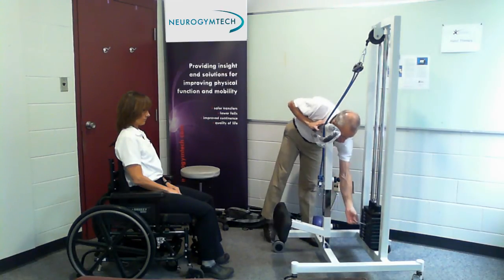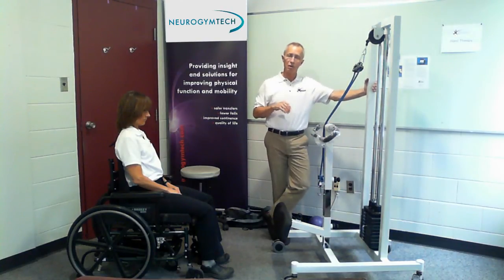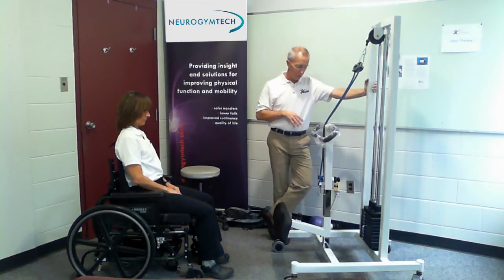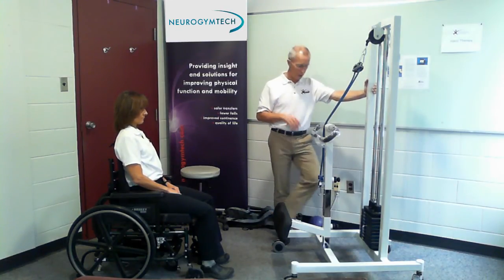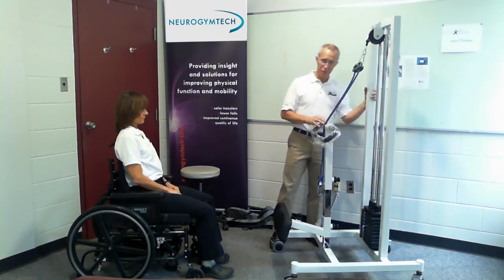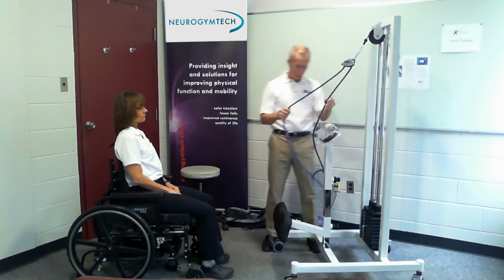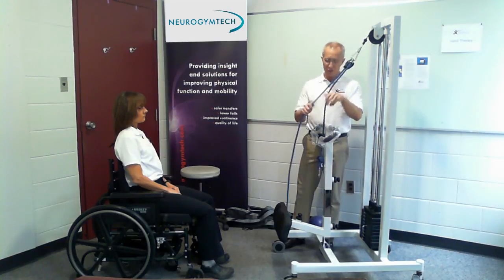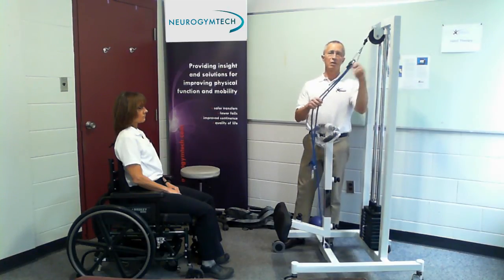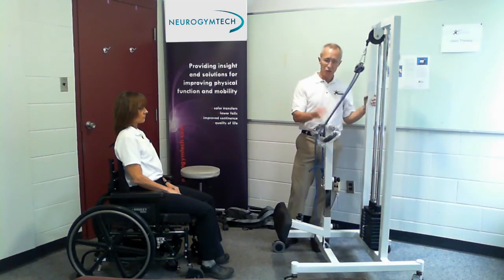There's a weight pin, which is pretty straightforward. We always start with 40 pounds because we don't know the person's ability to stand — the correct weight is a combination of their ability to stand and their weight. We know their weight, but not exactly how strong they are, so we always start with 40 pounds. This device is called a Petzl — if any of you have done mountain climbing, you'll know it's called a Grigri. This lever opens automatically and locks when there's stress on it. When you lift it up, it relieves — that's how you release the weights.